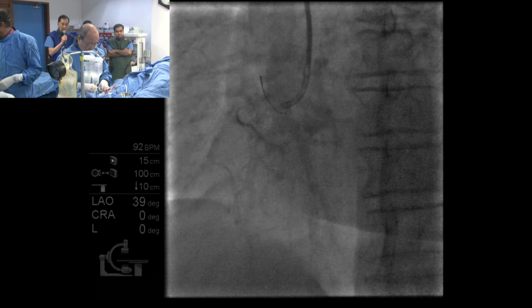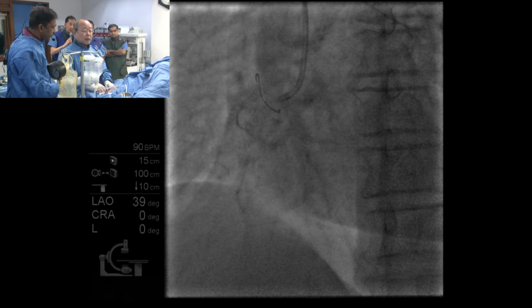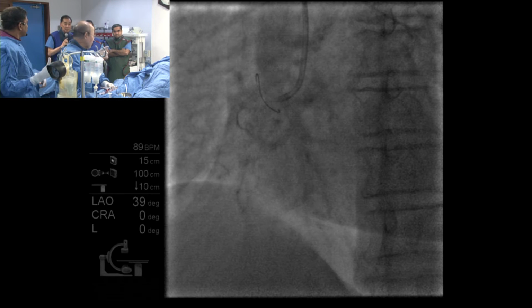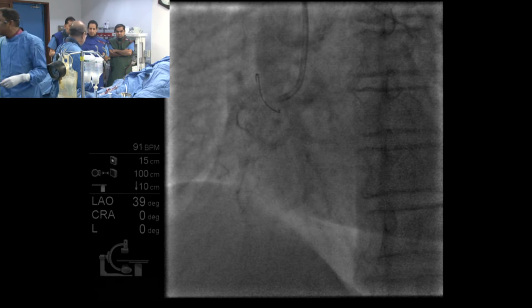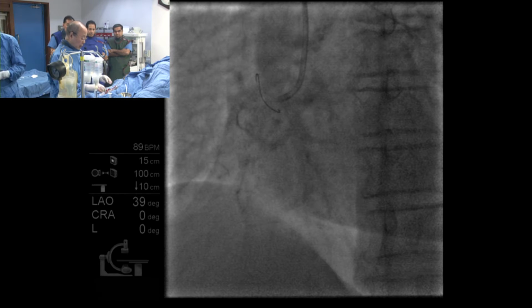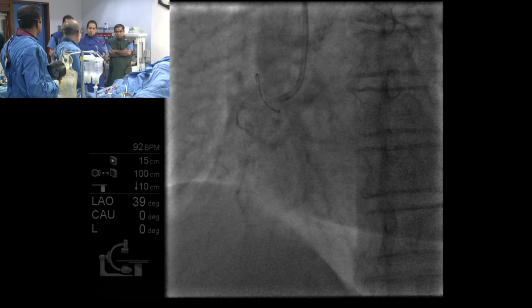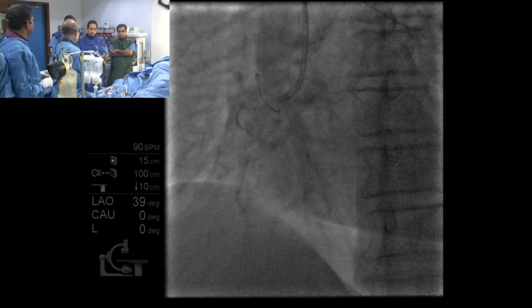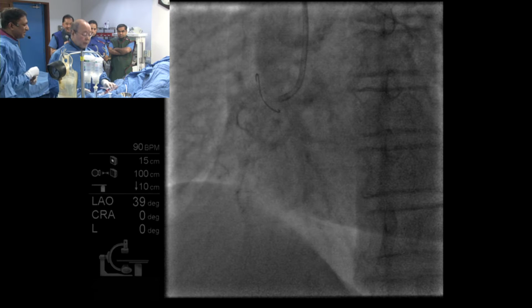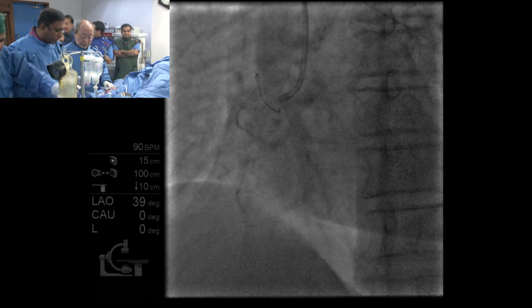Balloon line? Yes. Maybe because of the wedging. Yes. We made a side hole, but still the side hole is not enough. We made it by needle. 1.5 by 10.